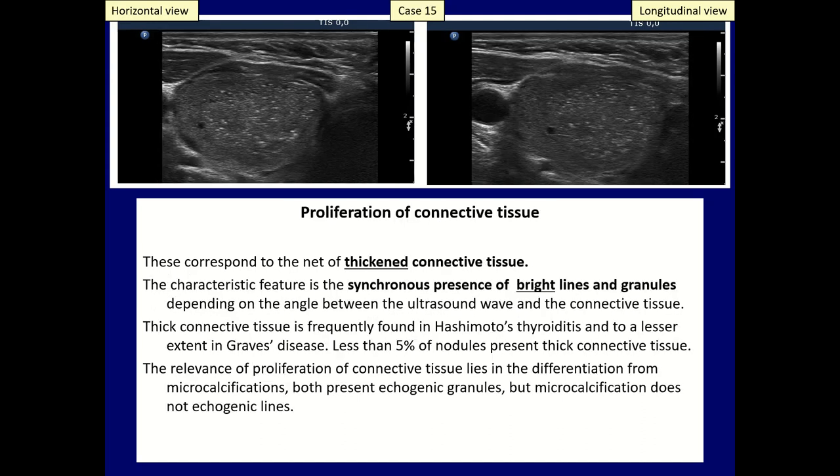The echogenic lines and granules become brighter if the echogenicity of the thyroid decreases, mainly in Hashimoto's thyroiditis, but also in Graves' disease.